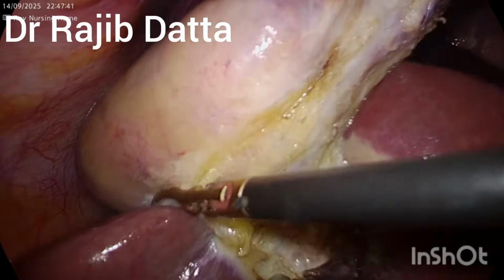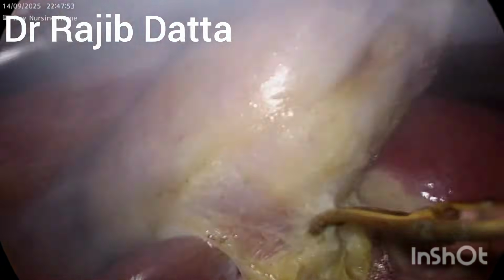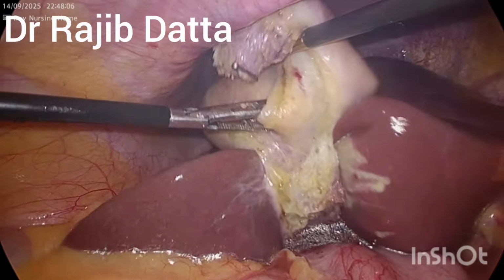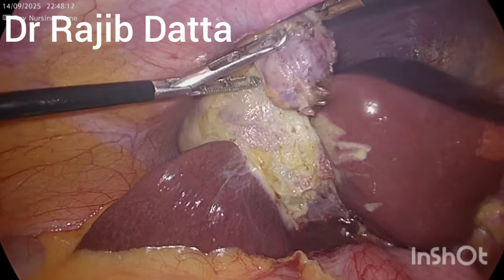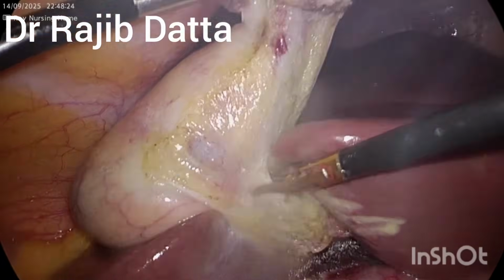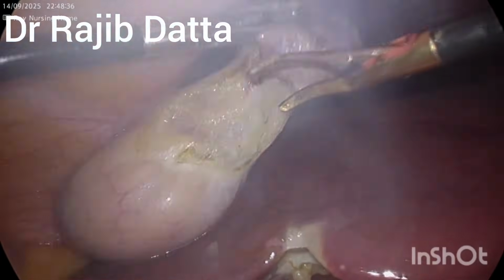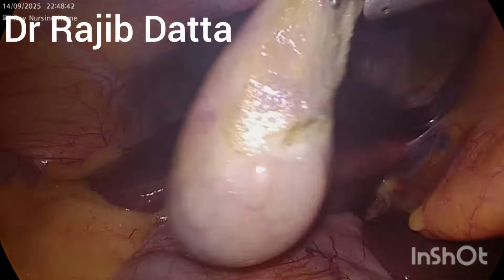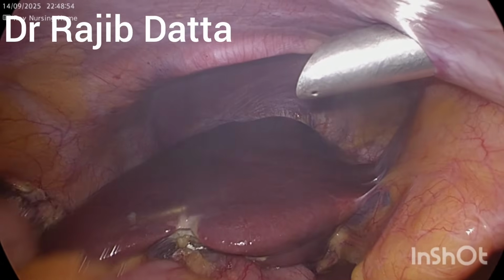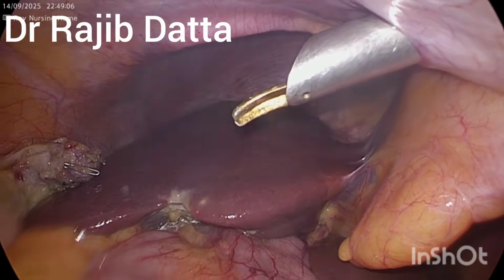Small bursts are the main key for proper separation and proper delineation of the plane. And now the last part of the gallbladder near the edge of the liver bed has been separated out. Now it is separated. Now we will introduce the endo bag.